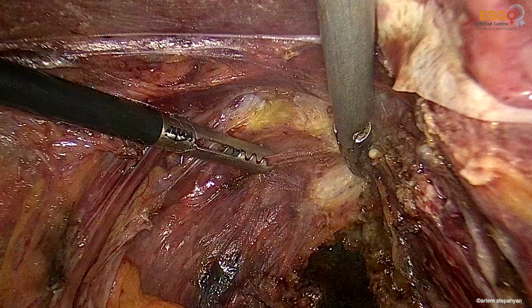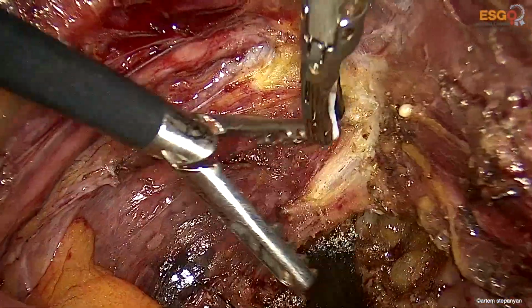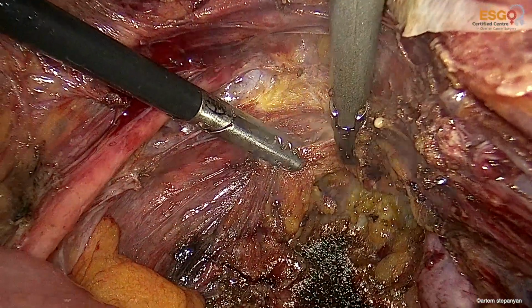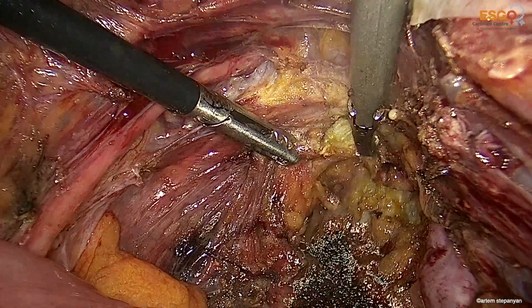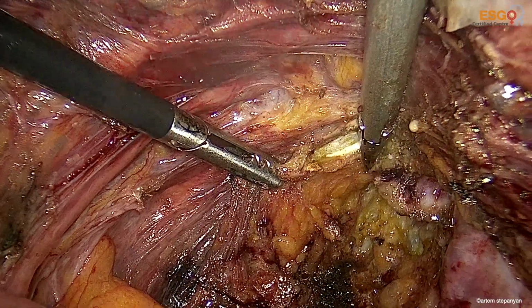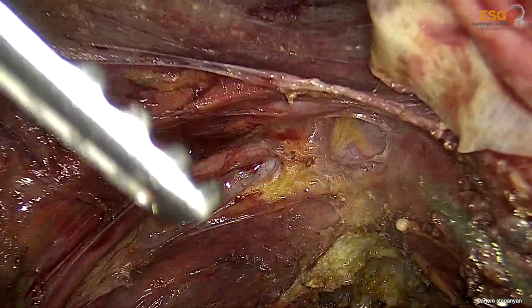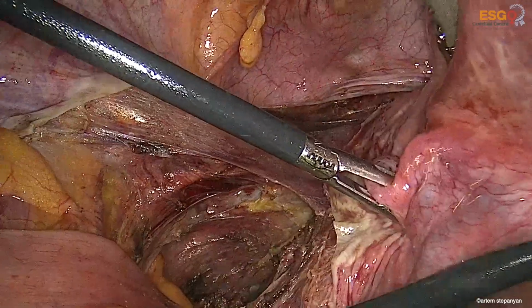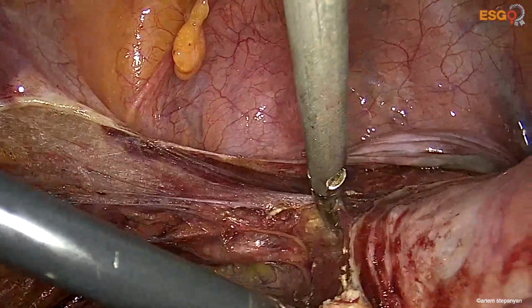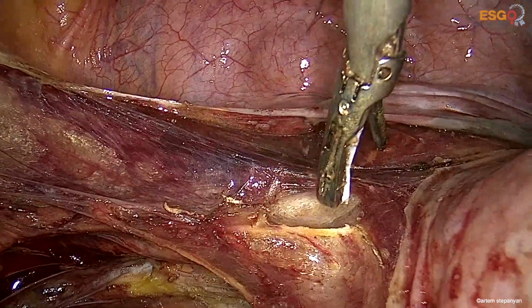And here you see that the uterine branches of the inferior hypogastric plexus are sacrificed. And it is okay because we need to preserve the bladder branches, but the uterine branches can be sacrificed with no consequences. A good traction, counter-traction obtains a good access to the important anatomical structures.